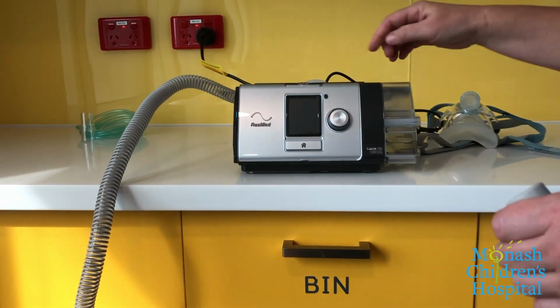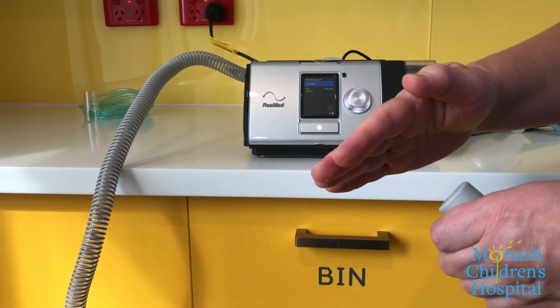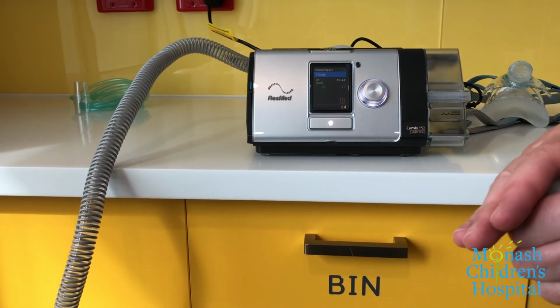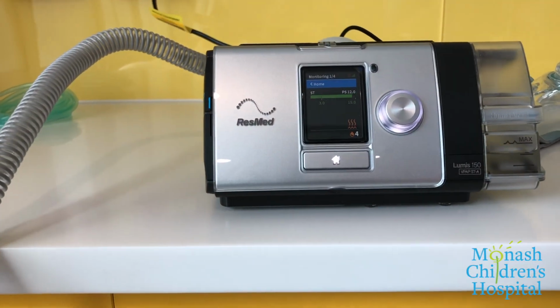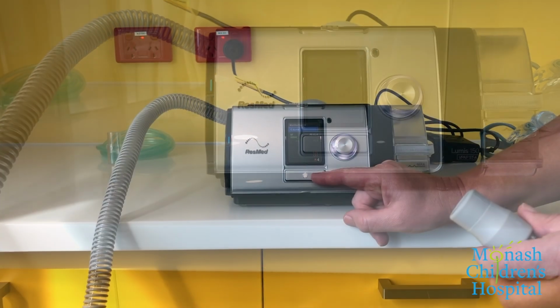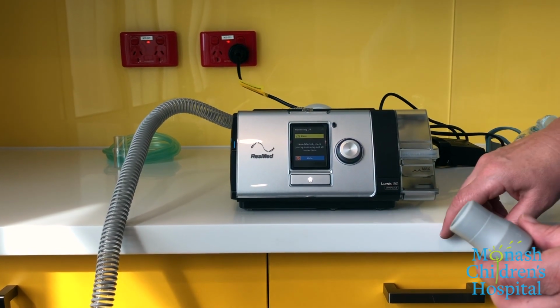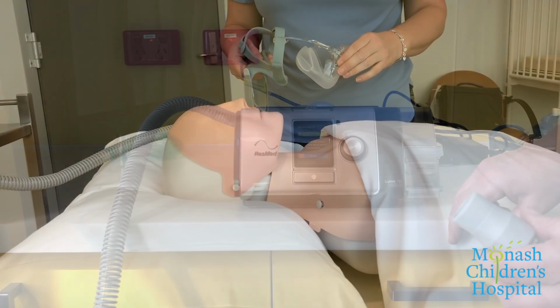Disconnect the mask from the tubing. Turn the machine on and check it is blowing air. Cover the end of the tubing and watch the screen to see that it is reaching the pressures you have set. If you leave the tubing open and the machine running, it will sound a high leak alarm.